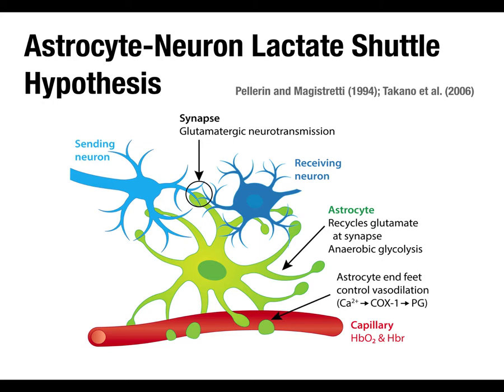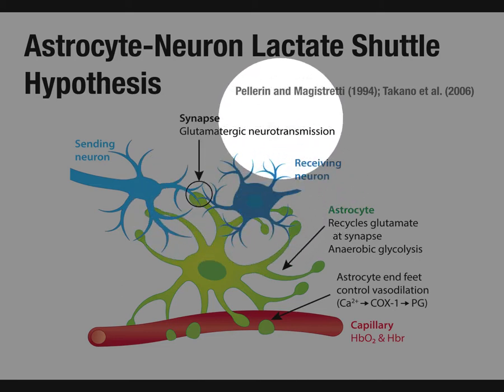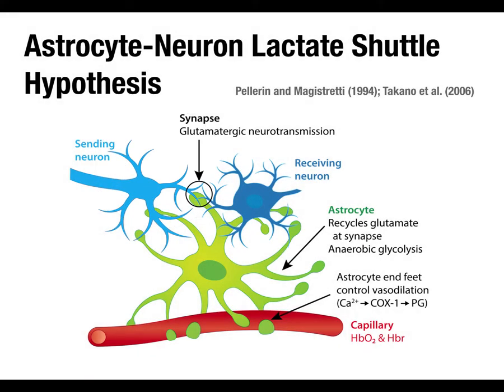What was the other thing I was going to say about that? Oh yeah, the other take-home message there, and this I'll come back to, is that what fMRI is really sensitive to is not so much the activity level of the receiving neuron as the activity level of the sending neuron. If you think about how neurons are structured, typically you've got the cell bodies that receive input and then an axon that goes out, and sometimes the axon goes to another part of the brain and sends signals there. So the short story is that the fMRI signal is actually more sensitive to the input to a particular brain area than it is to the spiking output of that area.